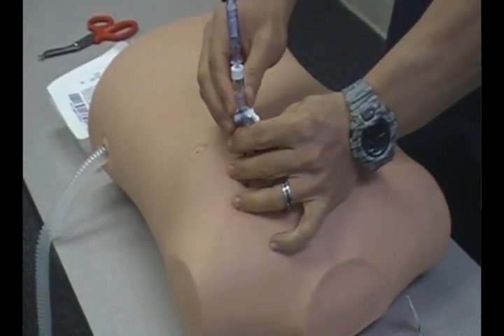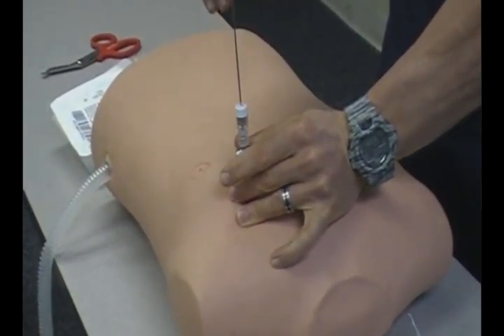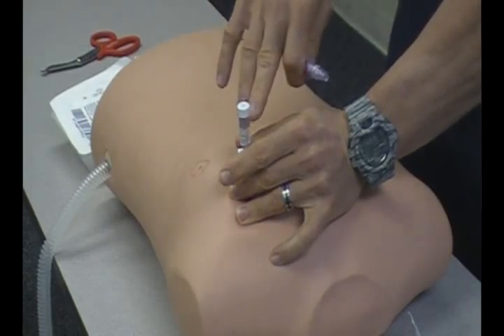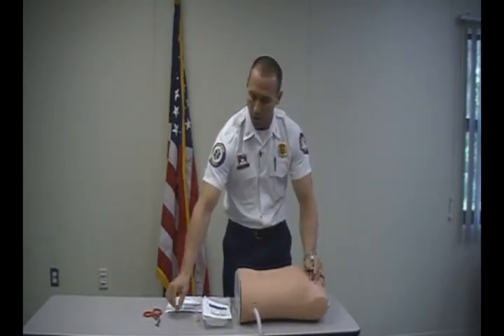Secure your catheter with your other hand and remove the needle. You'll hear a click — the ball will go down, which locks it and also engages the safety on the needle. This can then go to the sharps container.